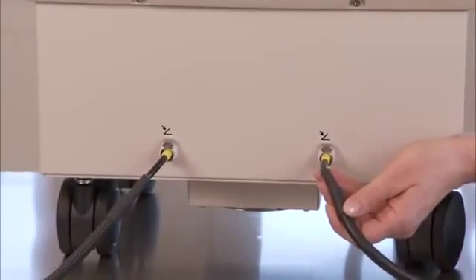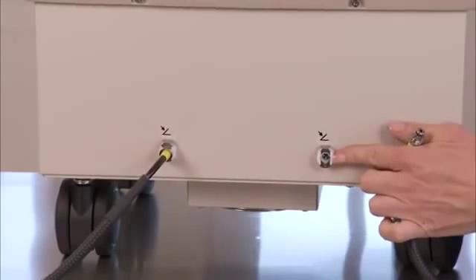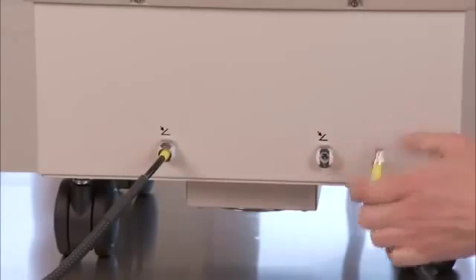Check to see if the foot switch is connected properly. Check to see if there are any foreign objects inside the connection for the foot switch.